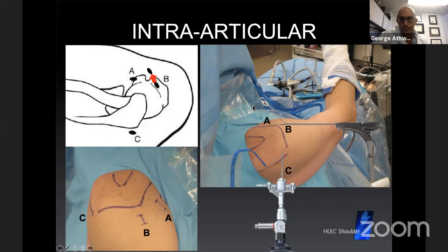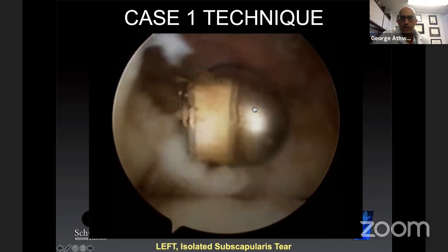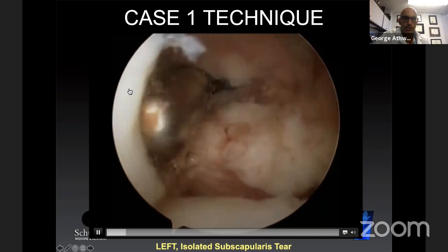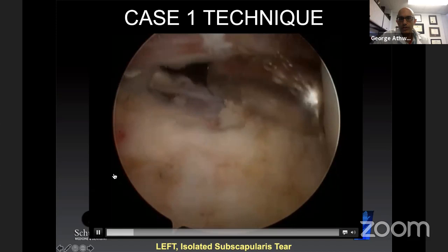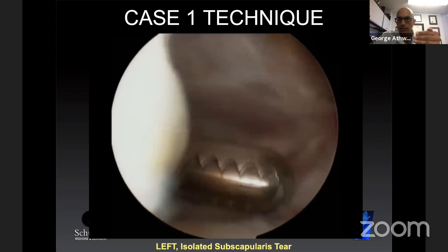This case is an isolated subscap tear. It's a left shoulder, I'm viewing from posterior, and there's a ruptured biceps on the right. With an isolated subscap tear, it takes a little more time to dissect out and remove some of that bursal tissue. Here is the leading edge of supraspinatus. I'm going to work through this, debride the bursal tissue, and then bring in my anterolateral, or B portal, just in front of the supraspinatus. This is where I'm going to do most of my work.